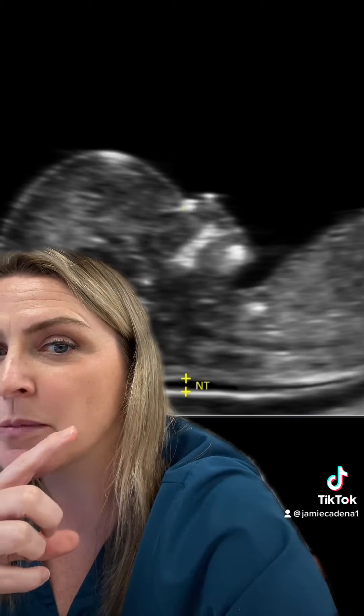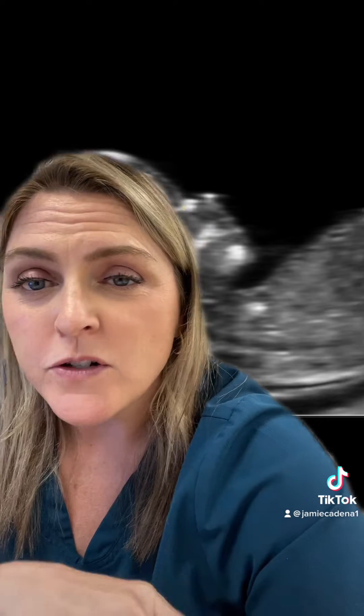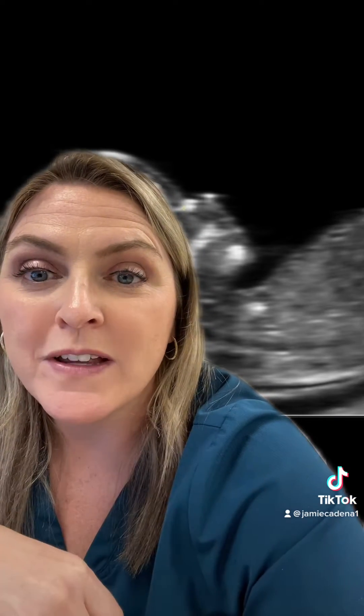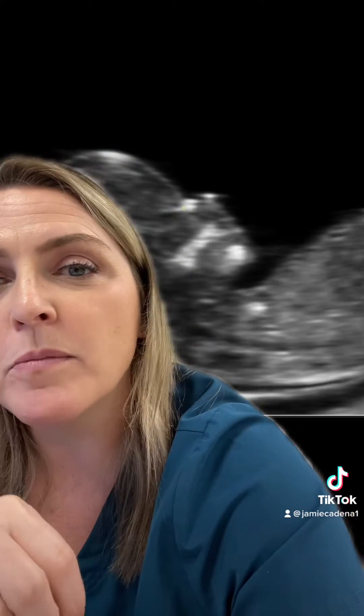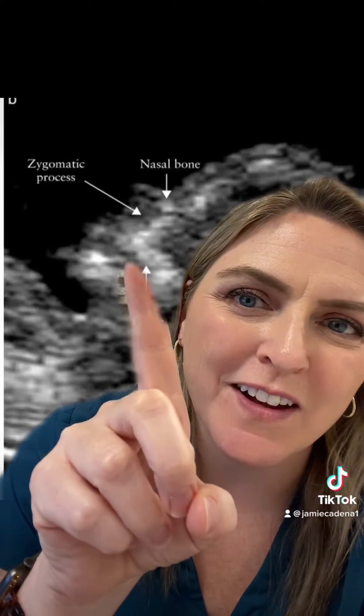The little calipers are how they're gonna measure. Now it is very important to make sure that there's not a slight deviation where you get the zygomatic process of the maxilla in the picture, which looks like this right there. If you have the zygomatic process in there, that means there's a slight deviation in how baby is laid.